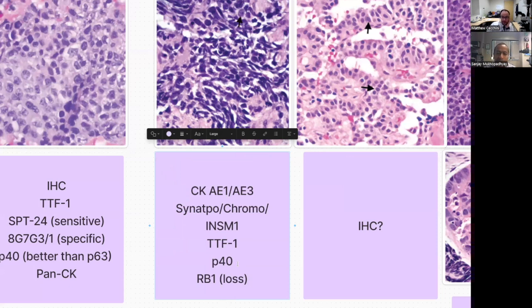What about you? Same. I put Ki67 on it as well, especially in these scenarios where it's crushed, and I just always worry that I'm looking at a crushed carcinoid, especially in a small biopsy. To me, that's kind of a safety thing. Also, depending on where you practice, some clinicians really want the Ki67 index, even though in the lung it doesn't have the same role as in other neuroendocrine tumors.